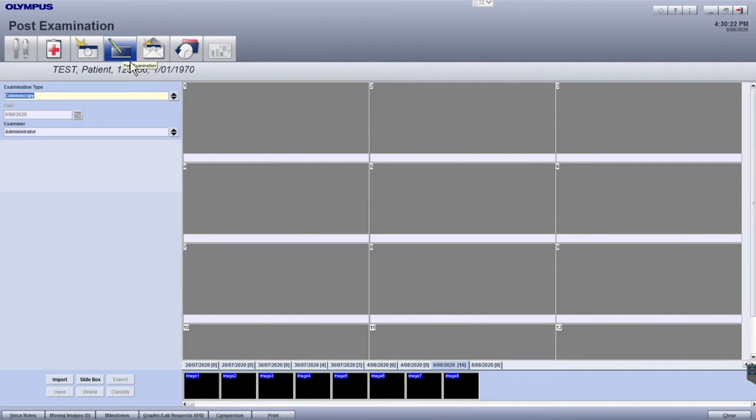Also within this module, you can change the examination type or the examiner details, if either of these have changed, or were incorrectly classified to begin with.